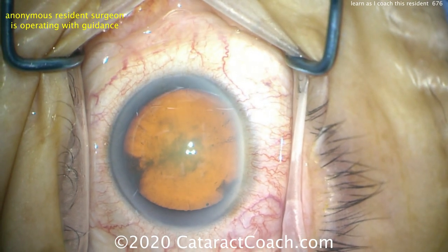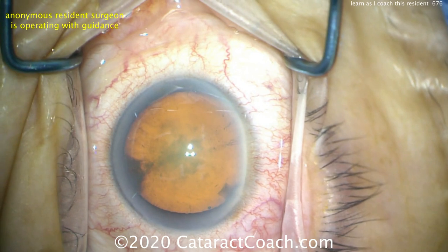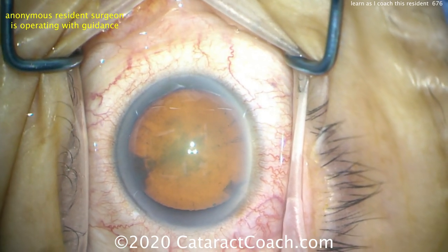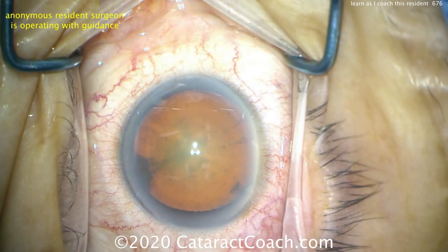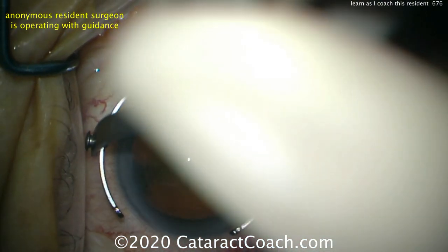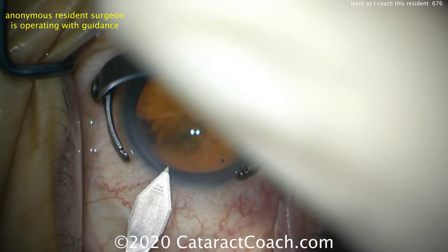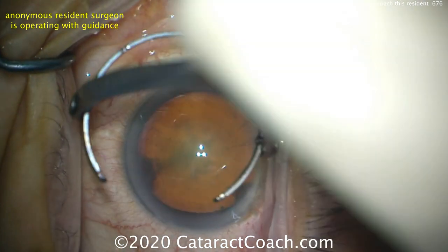This is going to be a 2.75 incision, so it's going to be keratome in the left hand for this left-handed surgeon, and then fixation ring in the right hand. The surgeon is now getting those instruments ready. Good job. Let's put the fixation ring down, angle it to where you want it. Here comes the main incision — going parallel to the iris first. Good.